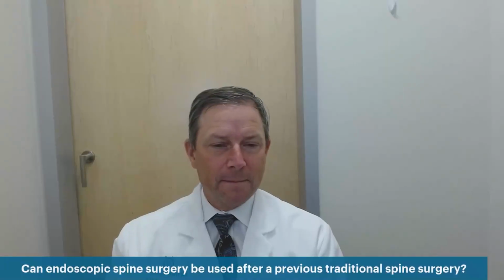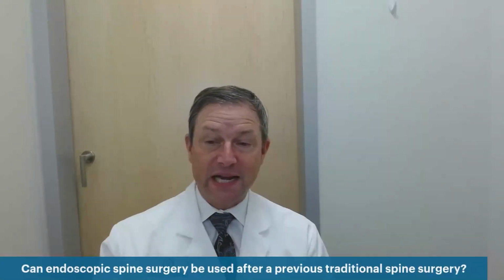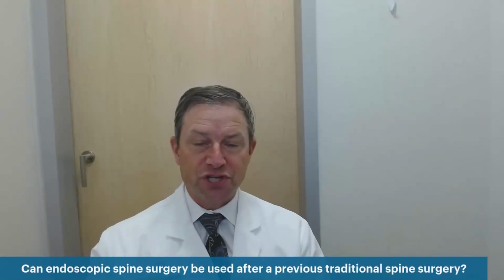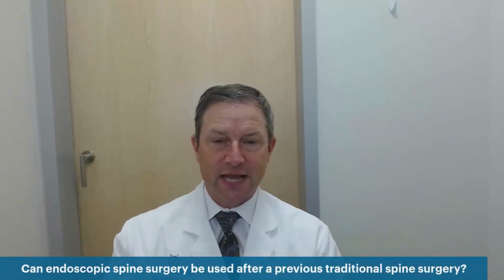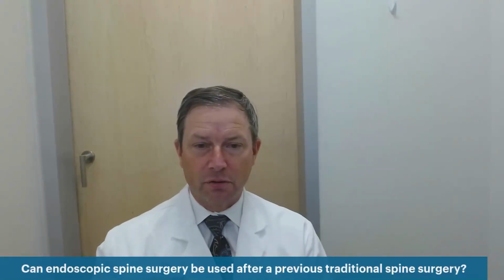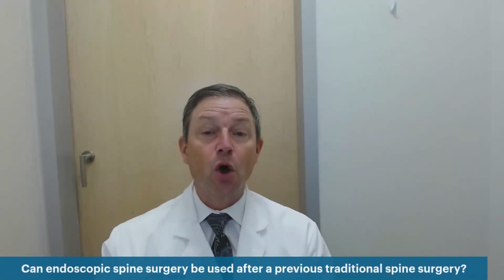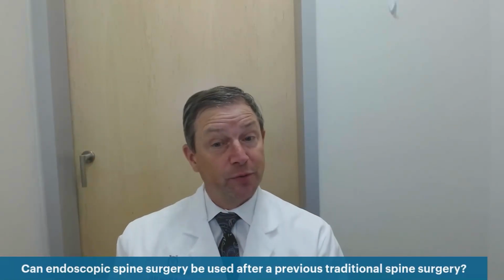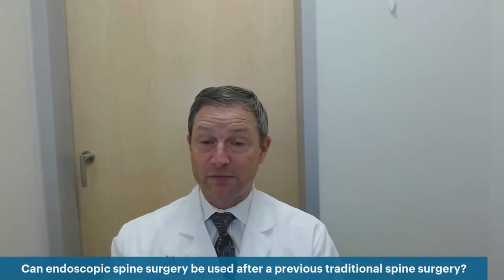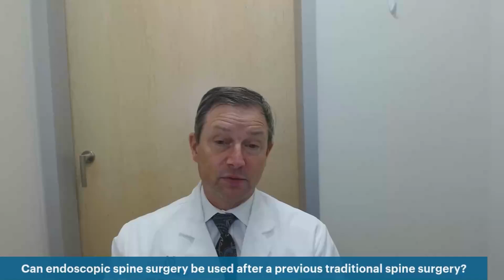So the first question is, can endoscopic spine surgery be used after a previous traditional spine surgery? And the answer is yes. It's one of my favorite procedures to use it on. Somebody's had a classic open or microdiscectomy or tubular discectomy, and they have a recurrent disc, or perhaps they have some scar tissue or some disc that was left behind.